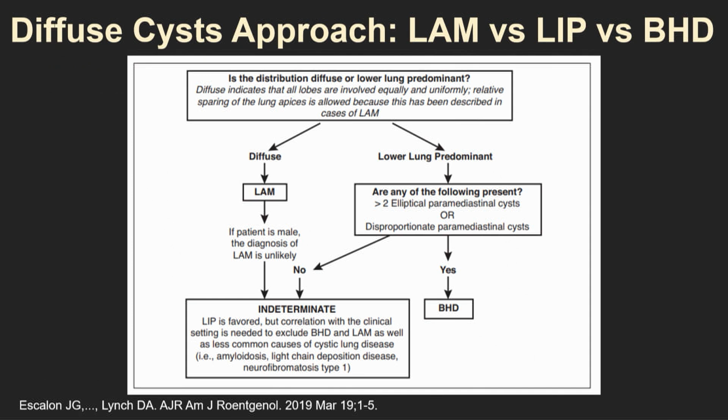So some people have told me my general approach, that was an approach a few slides ago that I teach all my resident fellows, seems a little bit elementary. Isn't there something more sophisticated, a more sophisticated way you can go about it? And so I said, yeah, there actually is, right?